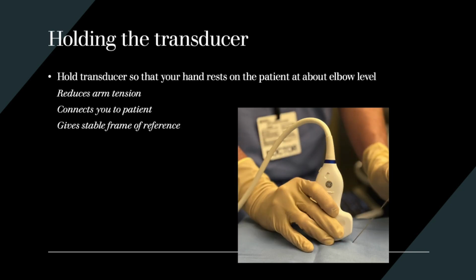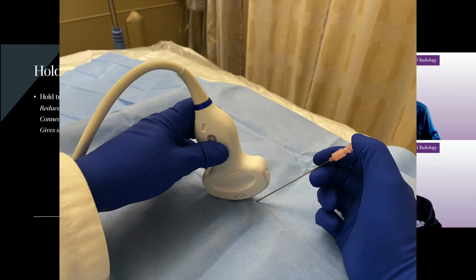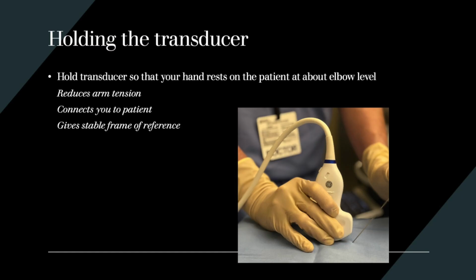So when it comes to holding the transducer, there's a tendency for the novice to hold the transducer by the handle so that their hand is kind of floating in midair. But that's a problem because then you're not stable, your hand position is drifting. And so it's better if you hold the transducer near the head of the probe so that your hand is resting on the patient's body. That has several advantages. One is that it reduces tension in your arm when you're not trying to stabilize the probe in midair, and when you're resting your arm on the patient, it just reduces the muscle tension in your arm, which will make you more comfortable. And it connects you to the patient, and that gives you a stable frame of reference.